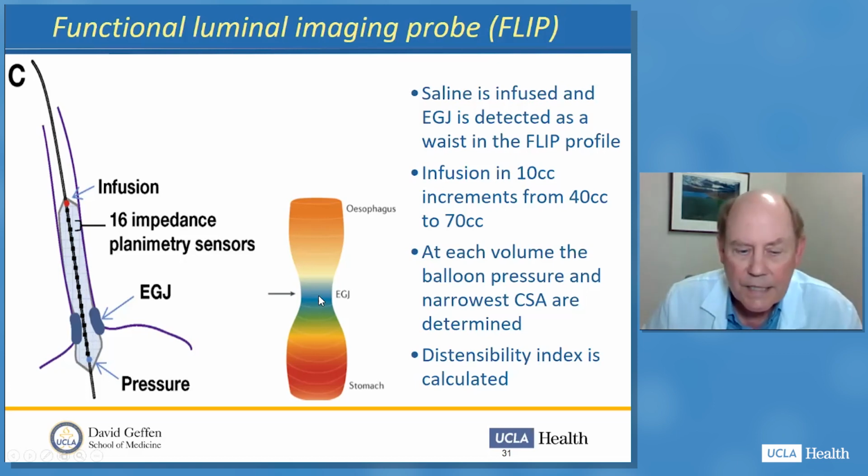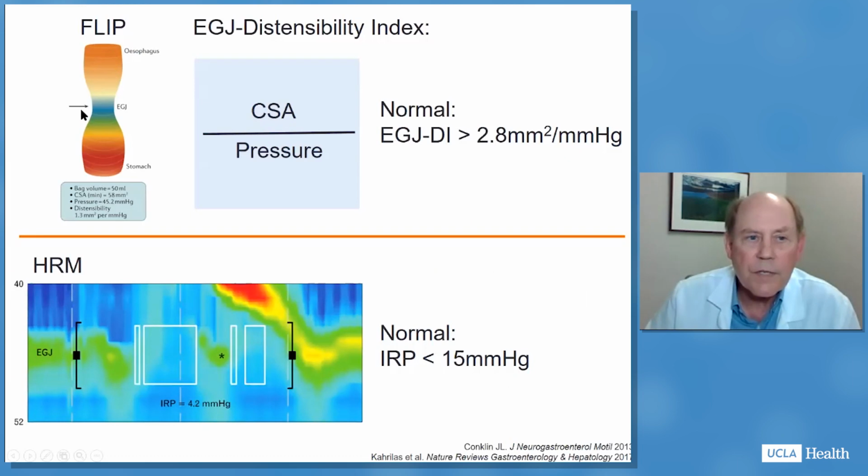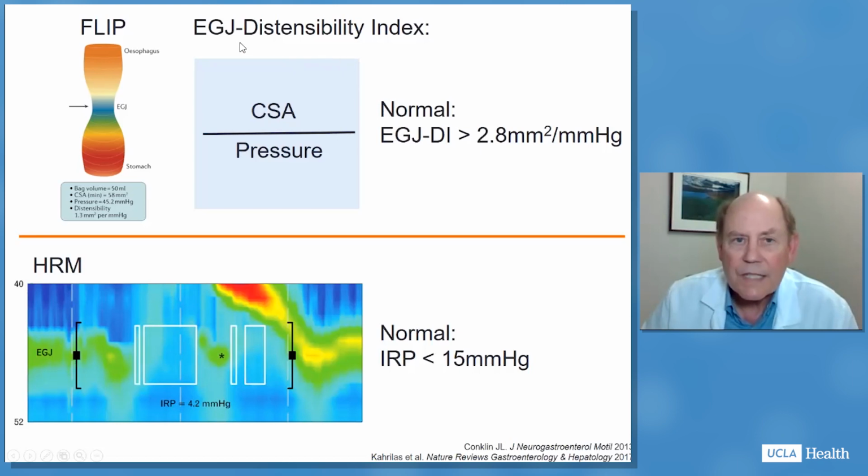So what is that distensibility index? Well, here's our image. This is where the smallest cross-sectional area is. And this equation, you've seen, is cross-sectional area divided by pressure, which is in this case called the distensibility index. Its other name is compliance. So the normal for the esophagogastric junction distensibility index is greater than 2.8 millimeters squared per millimeter of mercury of pressure. All right, so we're going to call this DI.